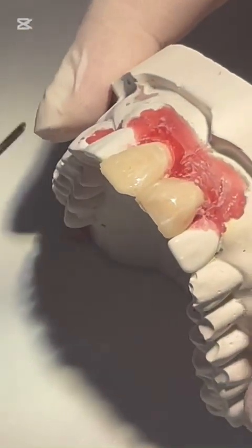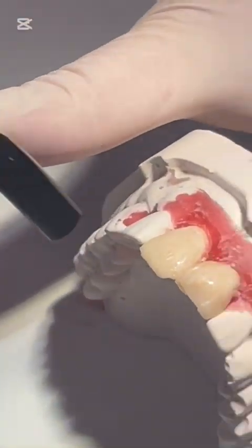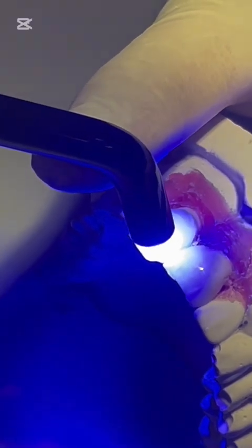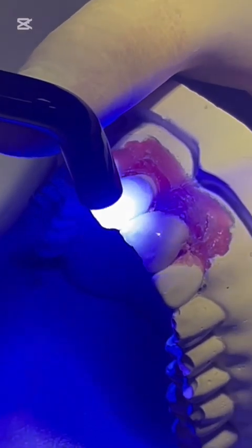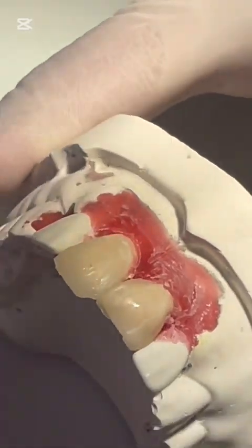Okay. Now I increased the width and the length for this central incisor. Why am I showing that? Because you will see a lot of patients coming to the clinic. They had previous diastema treatment and closure, and they are not satisfied. Diastema treatment does not mean that you should add some composite to the distal and the mesial and close the space. It means to create an aesthetic result that can make the patient more satisfied about his teeth.